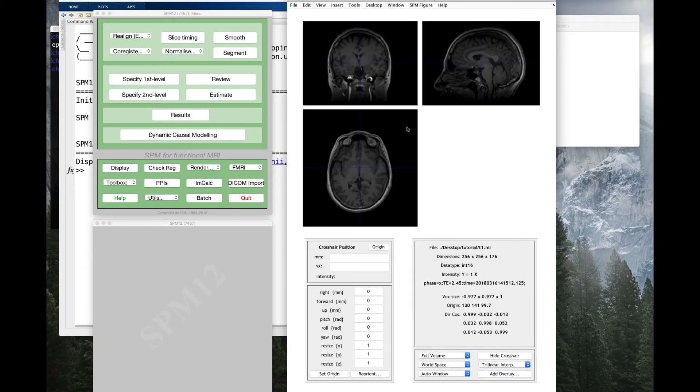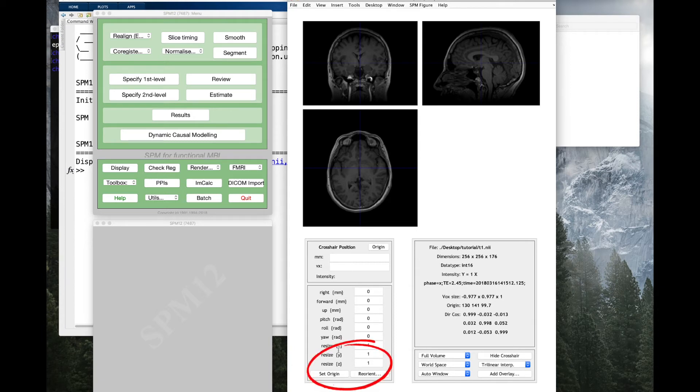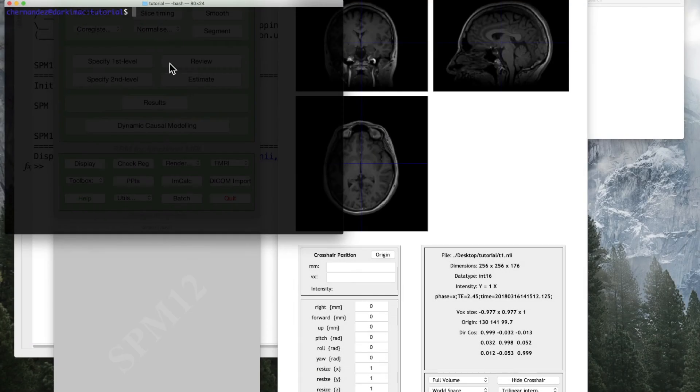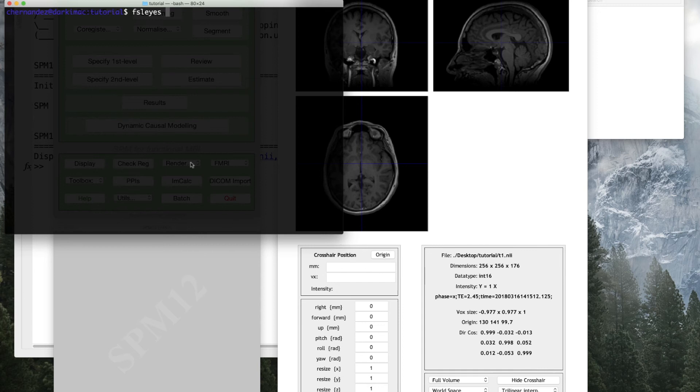These two operations can be performed either in SPM or any other software. It is also important to remember that any image that you want to use for your analysis must be properly aligned to the anatomical image that you are using as your starting point.